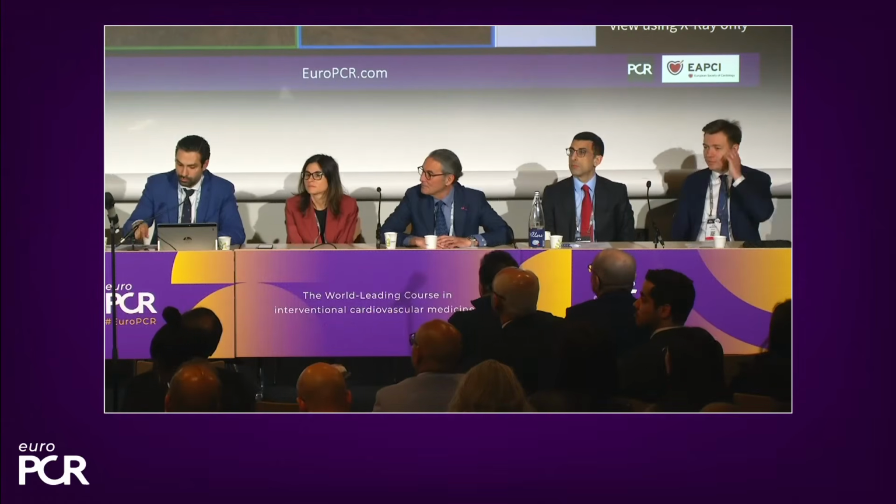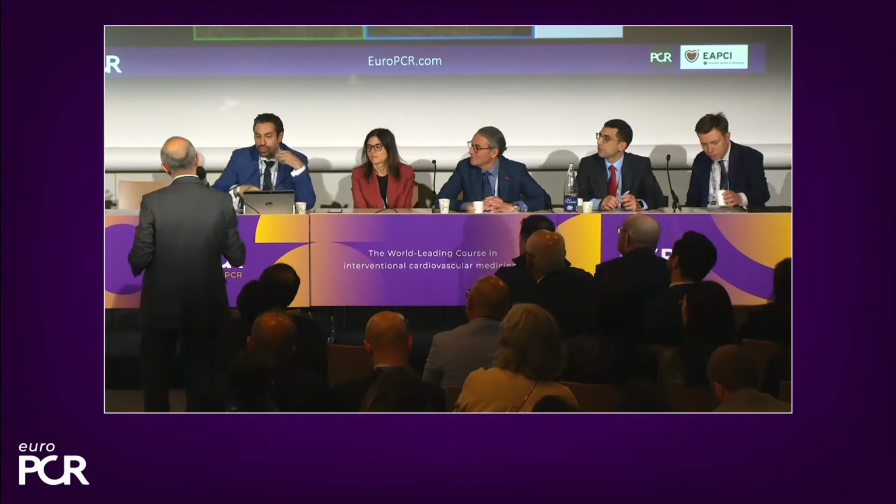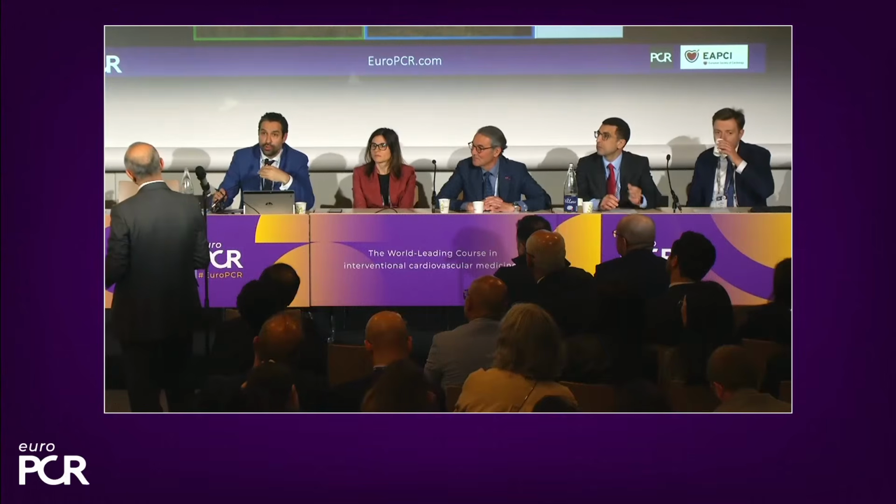Okay, last question, come on. Well, you said that the radiation is about 5% extra, but when you do it multiple times, it's going to be much more. But with the stent viz, the usual way we do it nowadays, we can also do angiography at the same time to save radiation. So we do angiography and we do stent viz on the same run. Can you do that with the 3D? So you can save radiation, you do angiography, rotational angiography, and stent viz at the same time. To use this technology, you cannot inject contrast at the same time, so you have to do the rotation without the use of contrast.